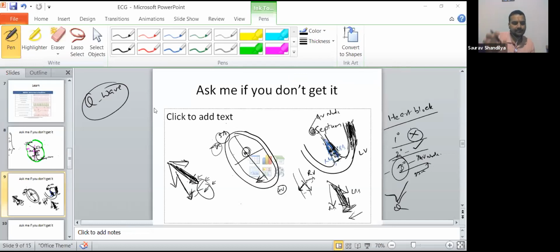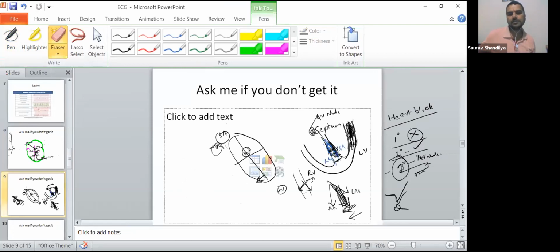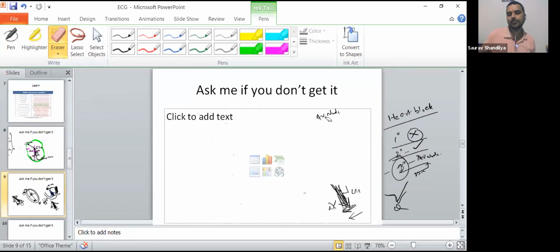The Q wave has a negative deflection for some time, not a very big deflection. Okay, it's normal. And then after the Q wave, we will be talking about the QRS complex. I'm not going through the QRS complex and finishing my class so soon. I'm going into very minute, finer detail. Of course, you don't have to do ECG, but you should understand the principles. The principles are very common. You have to record between two recording terminals, negative and positive or positive and negative. How do you place that recording terminal? How do the technicians place it? I will show you. You will remember it for a lifetime.